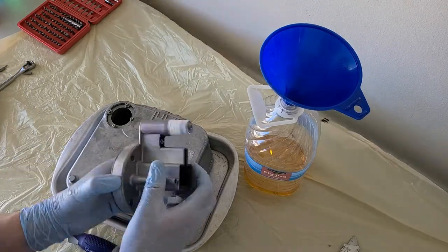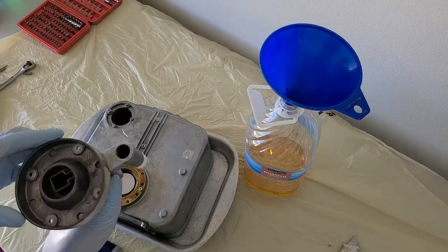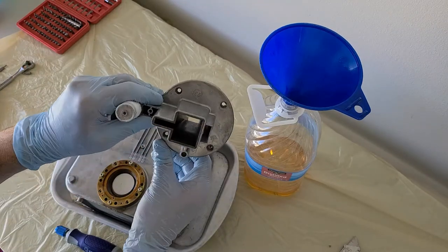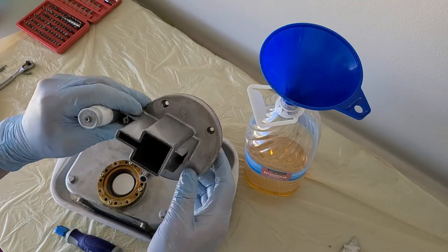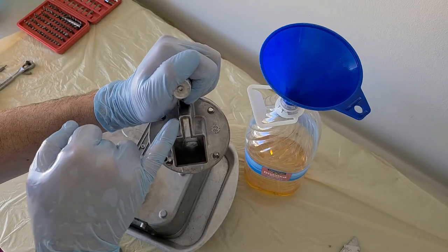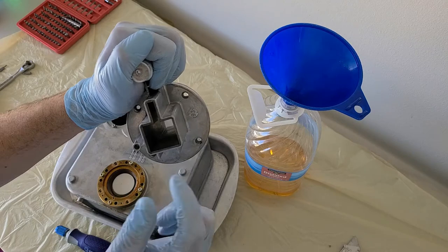Alright, so I got this little piece off. It's like the collimator. Basically, it's just there to narrow down the beam, make sure it's lead lined in here and no x-rays escape. It also has this little channel you can see right here to make like a thin slice of x-rays.